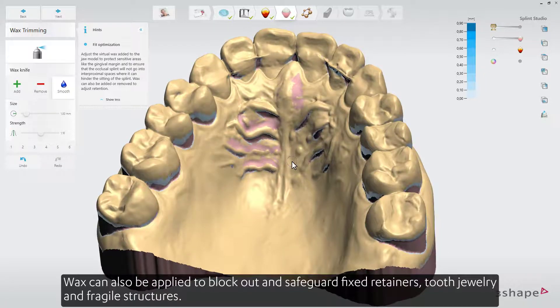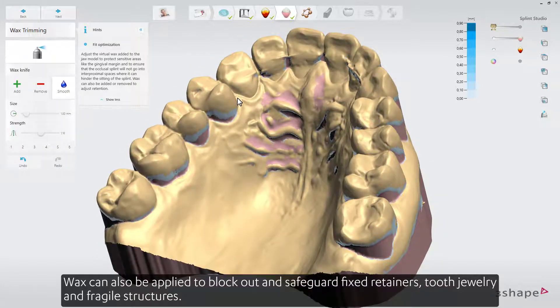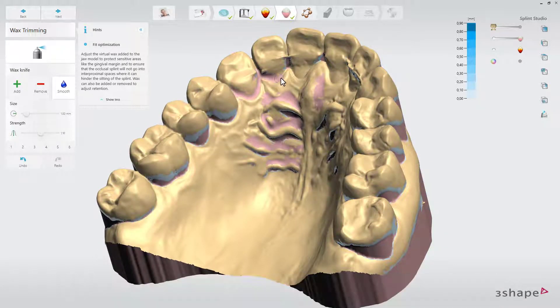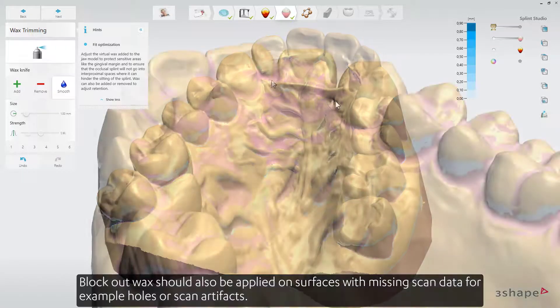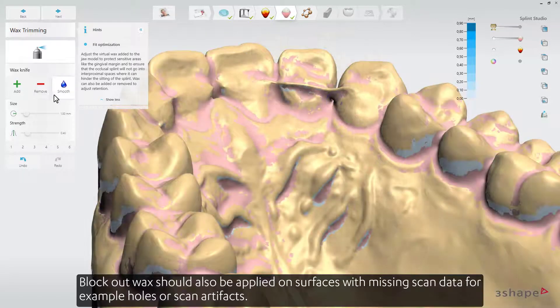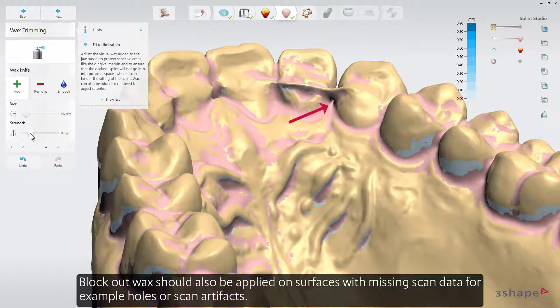Wax can also be applied to block out and safeguard fixed retainers, tooth jewellery, and fragile structures. Block out wax should also be applied on surfaces with missing scan data, for example holes or scan artifacts.